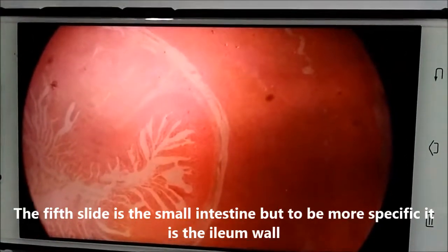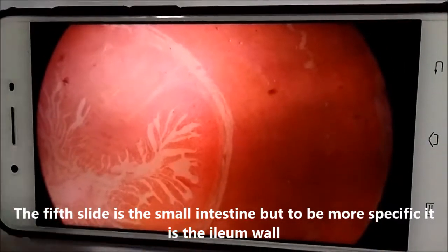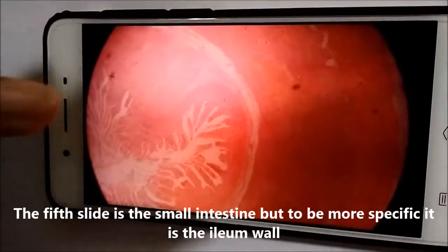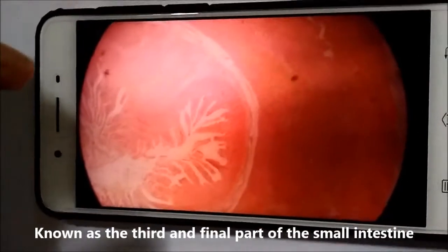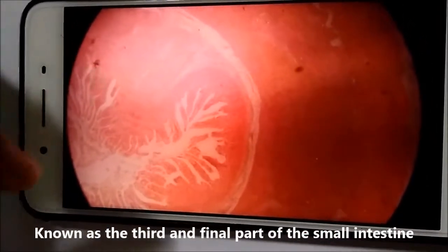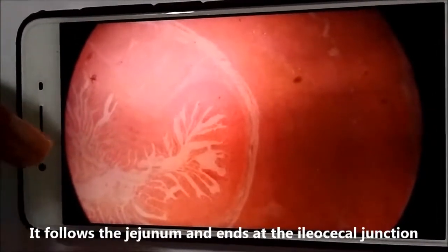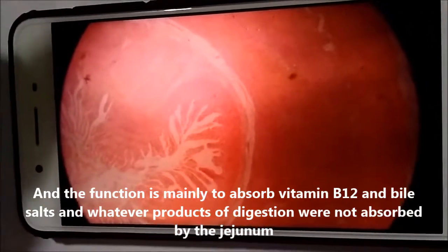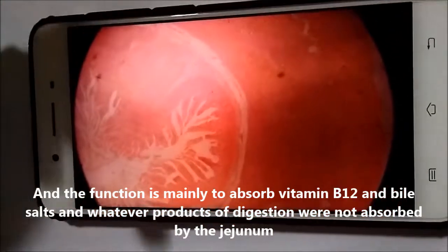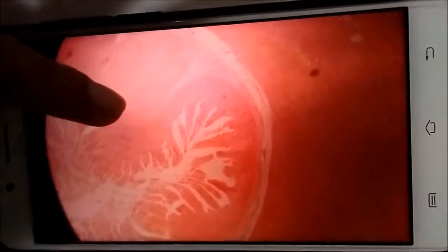The fifth slide is the small intestine, but to be more specific, it is the ileum wall. So the ileum is known as the third and final part of the small intestine. It follows the jejunum and ends at the ileocecal junction, and its function is mainly to absorb vitamin B12 and bile salts and whatever products of digestion were not absorbed by the jejunum. And we see the structure of the ileum from here.